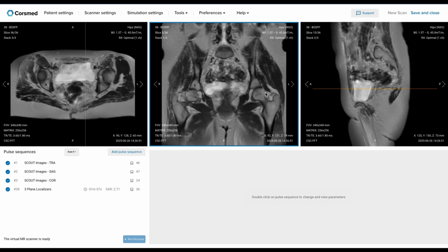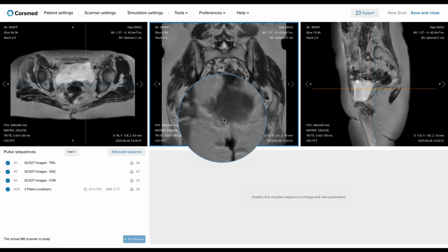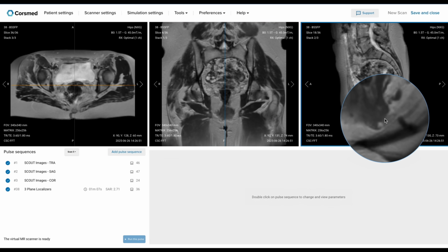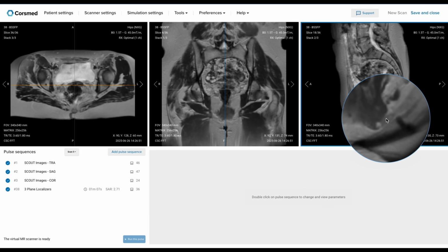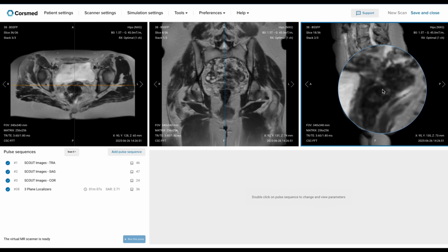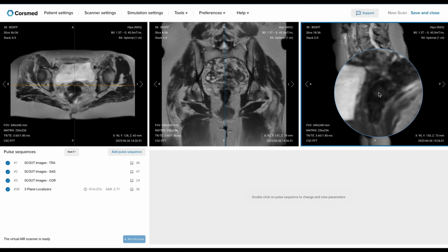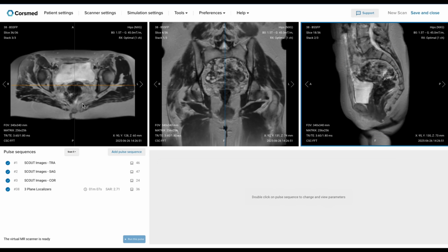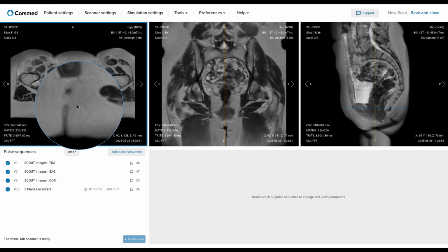for each one. We can start by inspecting this gray blob, which is the start of the anus and rectum. We can find it over here. This is the inner orifice of the anus, which will give us our angulation. Here is the main axis of the anus, and this is the main axis of the rectum. As you can see here, the rectum is actually full, so there's not only air or gas in the bowel, but also feces. In the axial, we can see the outer orifice, this little guy over here.